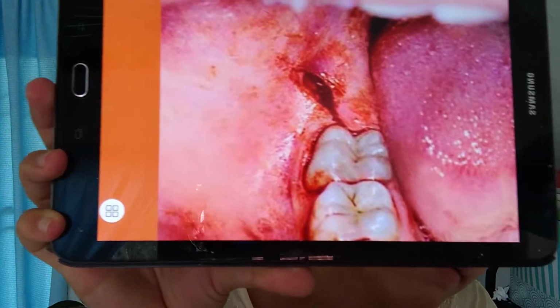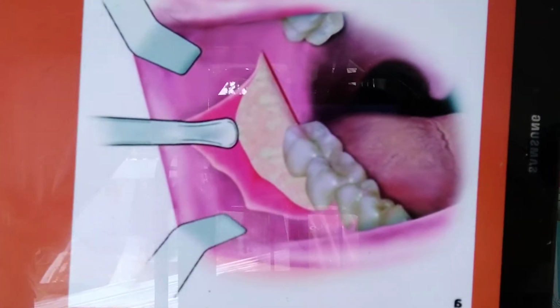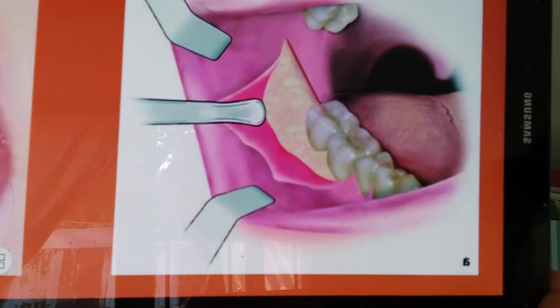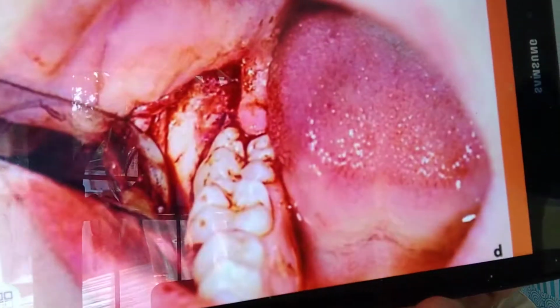Clinical photograph. Okay. Your reflection of the flap begins at the interdental papilla at the mesial aspect of the first molar and continues posteriorly along the incision as far as the anterior border of the ramus. So this is the clinical photograph.